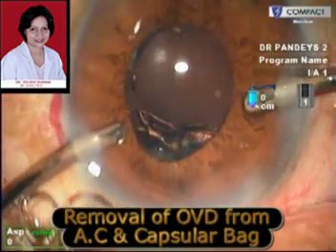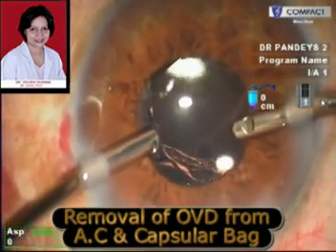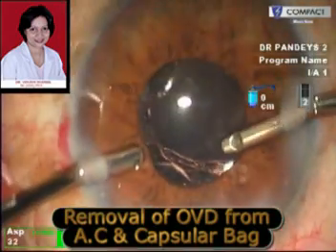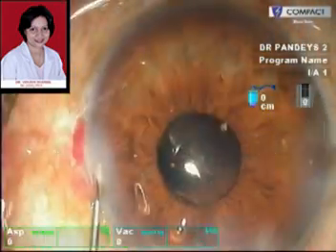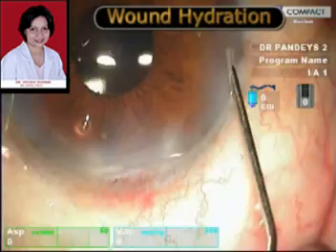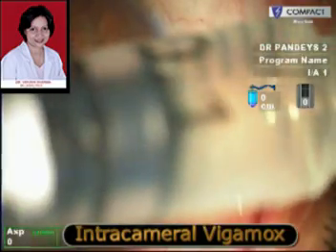The viscoelastic device is then removed from the anterior chamber and the capsular bag, and also some small bubbles of silicone oil can be removed during this irrigation aspiration. The wound is then hydrated, the IOL is well centered in the capsular bag, and the cornea looks clear at this stage.